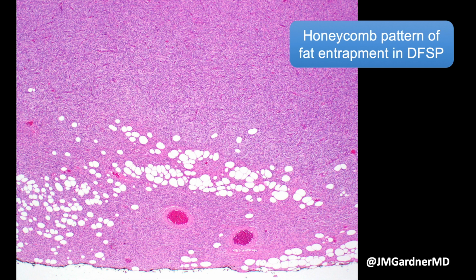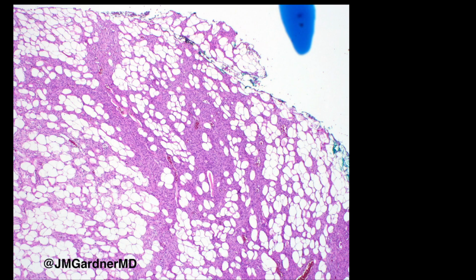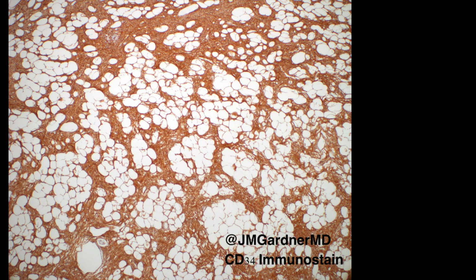So that's a really important thing to know about, and I particularly feel like I see that scenario where there's very little fat trapping because the tumor has grown over all the subcutis. I see that most often, I think, in the scalp, where the tumor kind of grows down to the galea or the periosteum and then hits a wall there and spreads out, and in the middle all the fat gets replaced except for just a tiny bit. So really important to know about that.